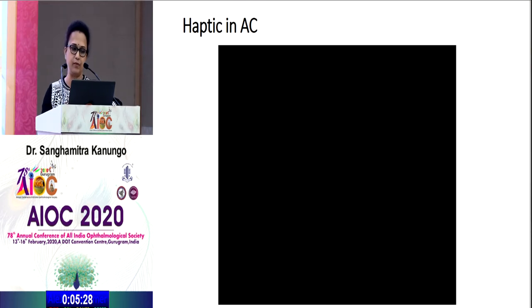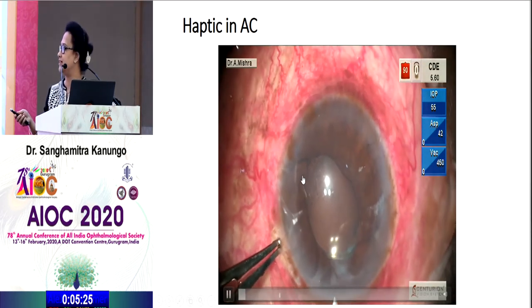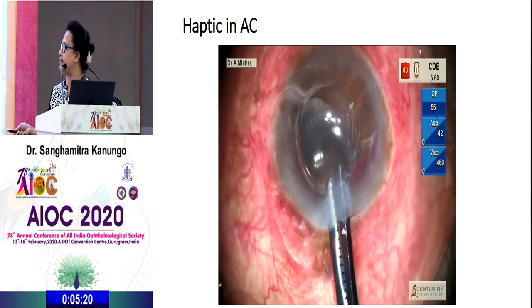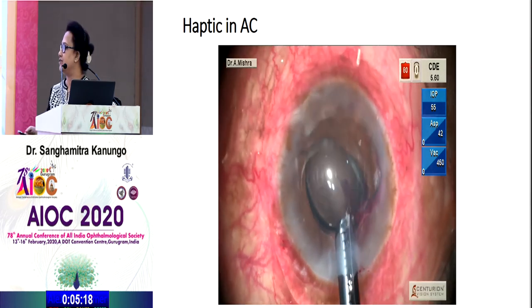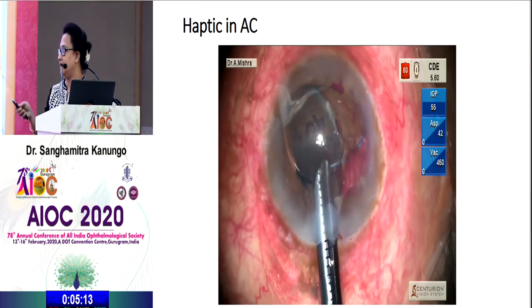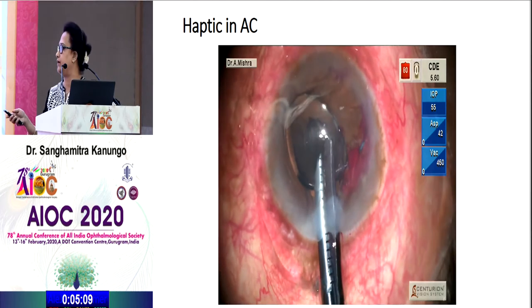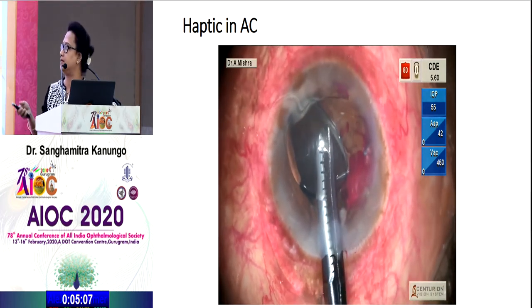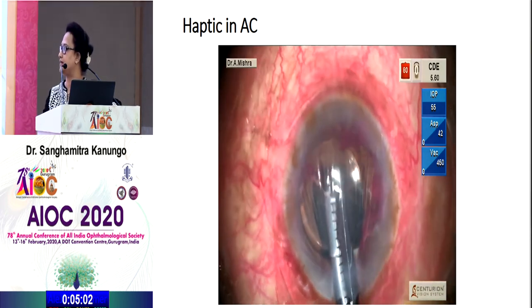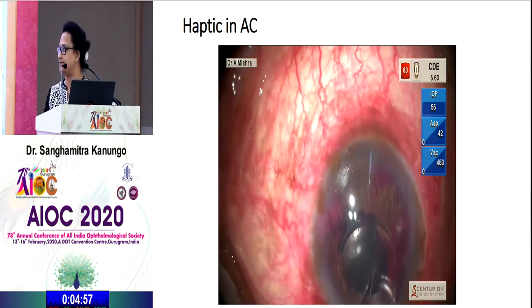This is a similar case as shown by Dr. Swin previously — an IOL where both haptics of a three-piece IOL are in the anterior chamber. Viscoelastic is applied and the haptics are loosened from either end. These haptics could have been tucked in and done as SFIOL, but the surgeon preferred not to. The optic was cut, the whole IOL retrieved, and the patient was sent for a secondary SFIOL.